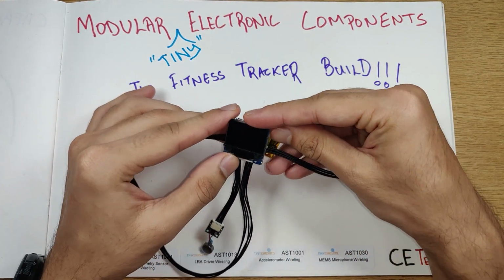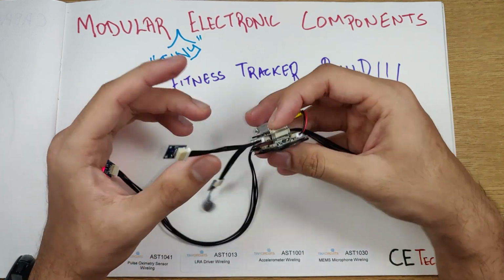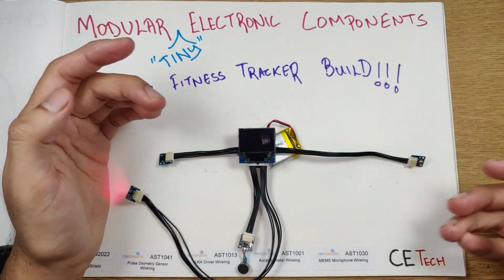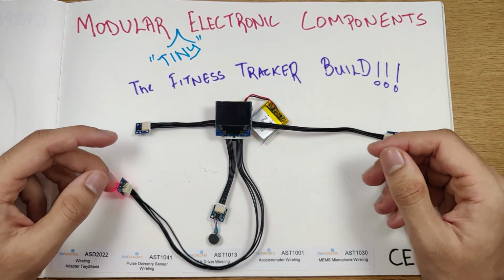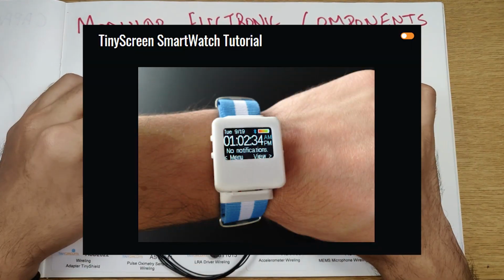Right now it's powered with the battery. If I press this button, it shows all the details, it shows the battery percentage as well. It's a pretty handy and easy to make thing. All the effort goes into the coding, because there's not much hardware connection that you need to do, with the soldering and stuff involved. You can make a smartwatch out of this as well.